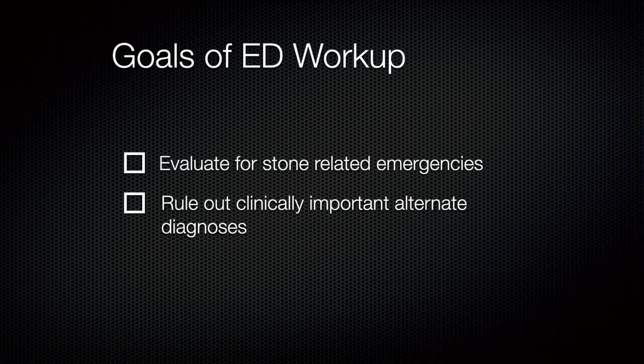Number two, we have to rule out clinically important alternate diagnoses. In an ideal world, we just know what the patient's got, and you say, this is exactly what the patient has. But we may not have that luxury in the real world.